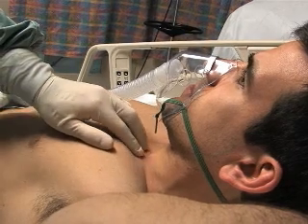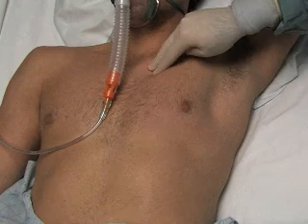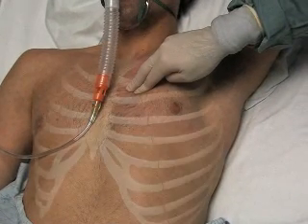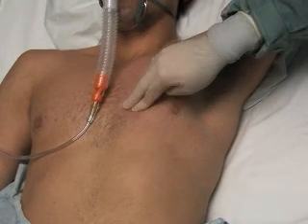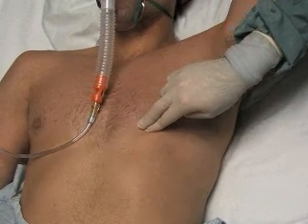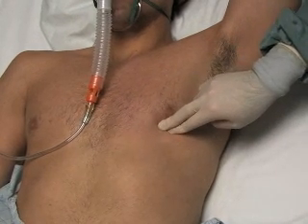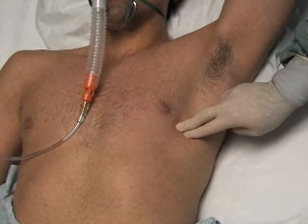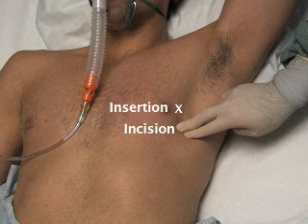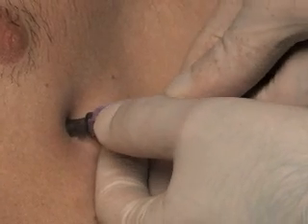Start landmarking by localizing the clavicle, then count the rib numbers as your fingers traverse down the anterior chest wall. Once the correct intercostal space is found, move your hand laterally towards the anterior axillary line. The incision will be made here, while the chest tube will actually be inserted one interspace above this point. Mark the incision spot with the imprint of the back of a needle or a pen marking.